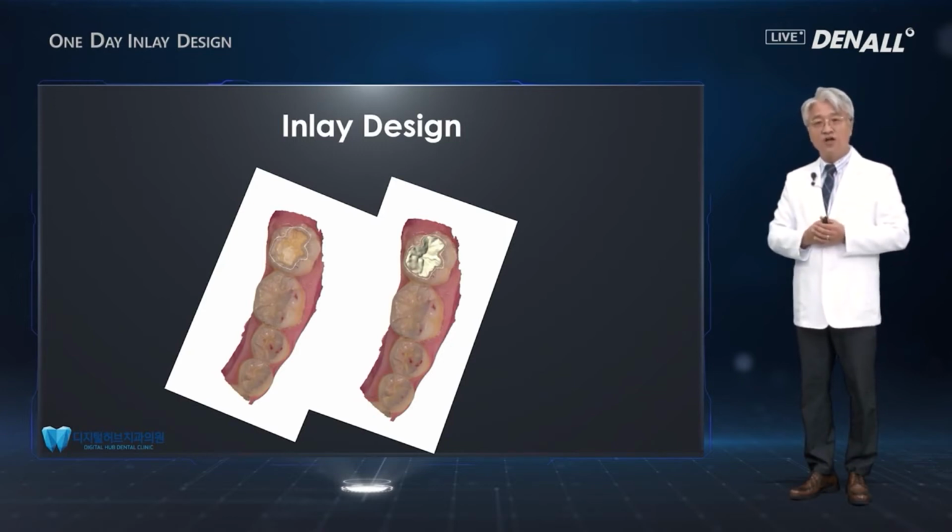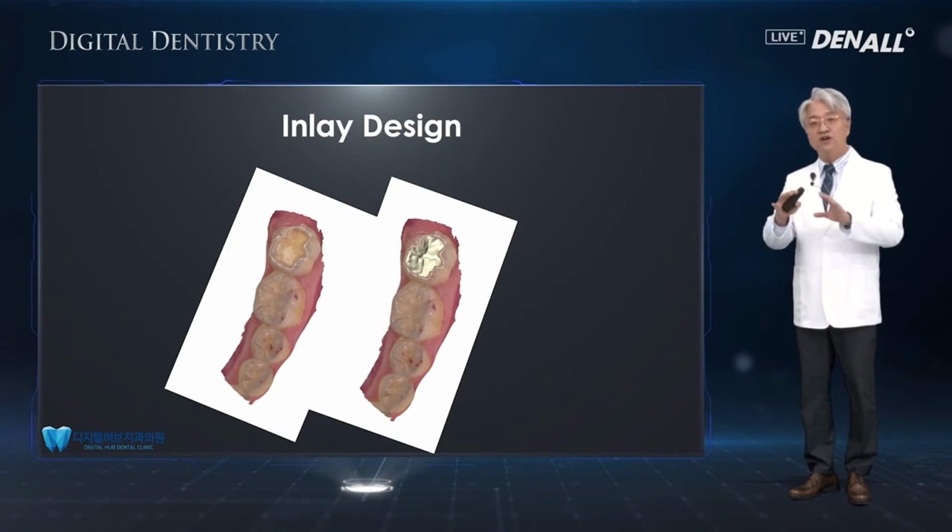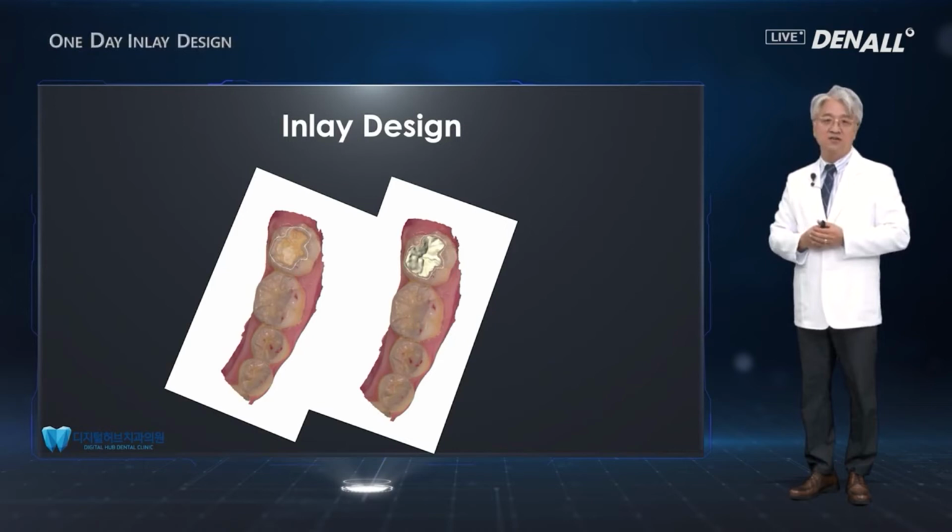But now, with the usage of the 3D printers and 3D printable resins, we can now deliver good strength and long-term stability. And now that type of products are becoming available on the market.